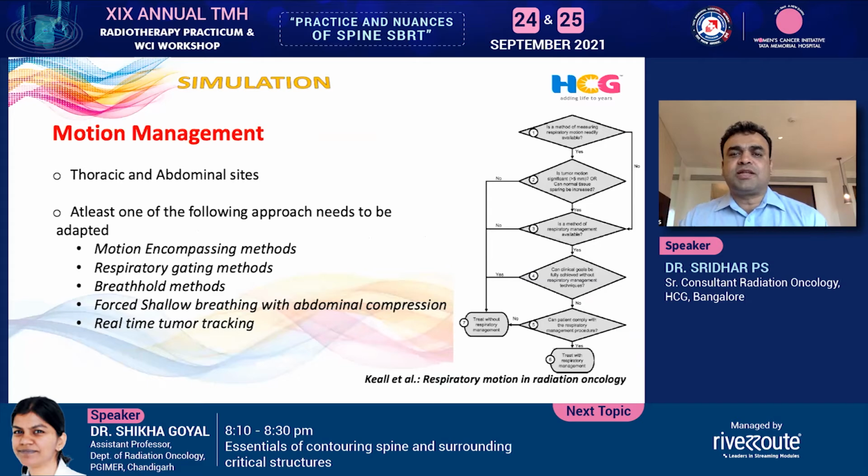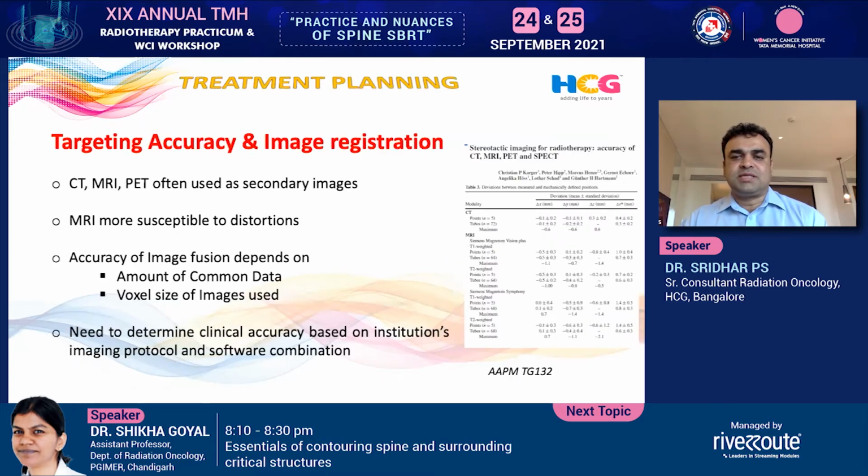Motion management is not a key in these cases, because with good image guidance I don't give importance to motion management, such as respiratory gating and all those things. Actually, it may not be required, so we don't use those things.